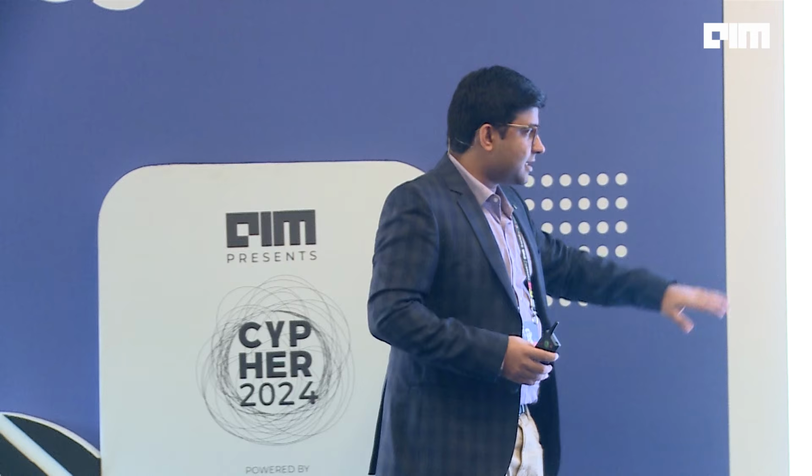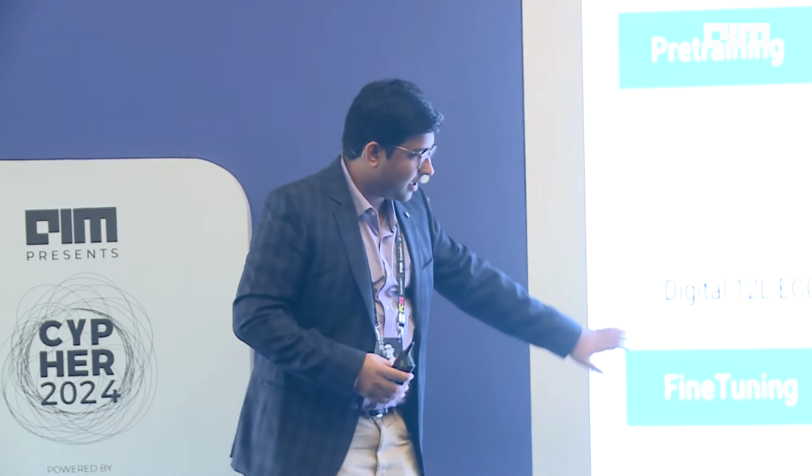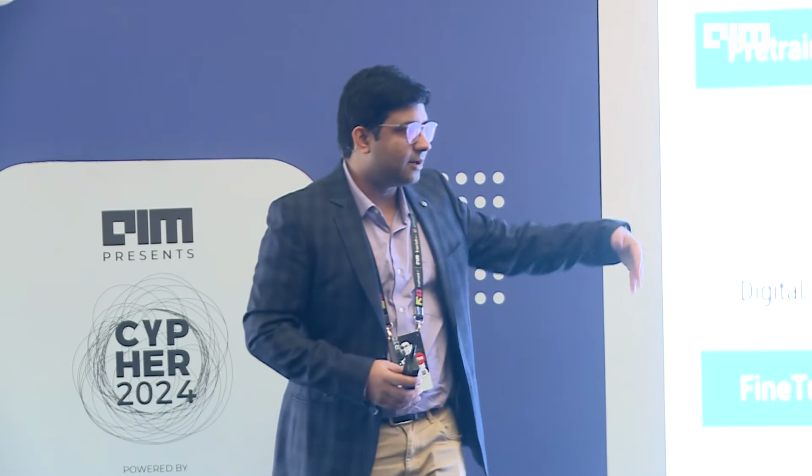Otherwise, you need a labeled dataset. That is a simple fine-tuning task. If we have enough labeled dataset, we don't need this. We can directly use labels and train for it. But we don't usually have, in healthcare, all sorts of labels for a specific disease. If you want to detect normal, it's easy. But normal is not usually required for patients. They want to detect diseases which are rare to find.